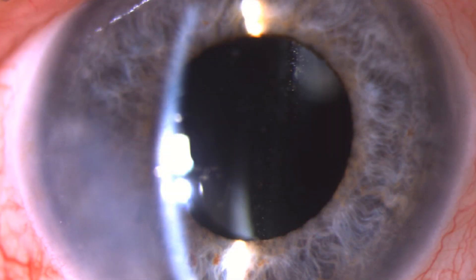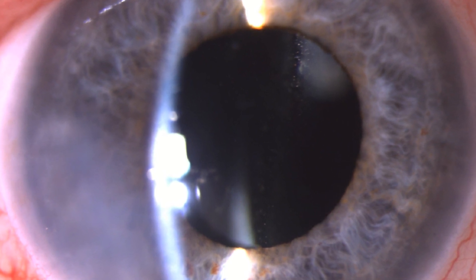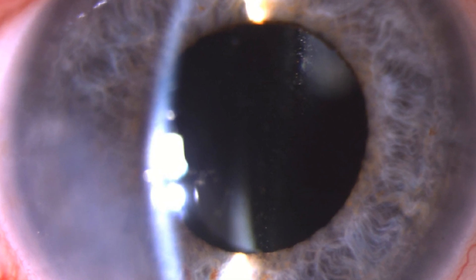This is a slit lamp view from the next day in the office. The patient was 20/25 with a correction of minus one. Thank you for your attention.